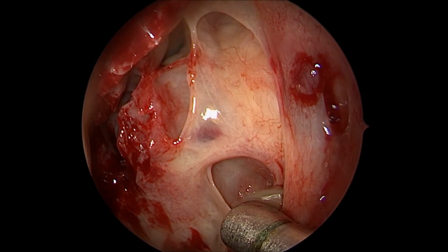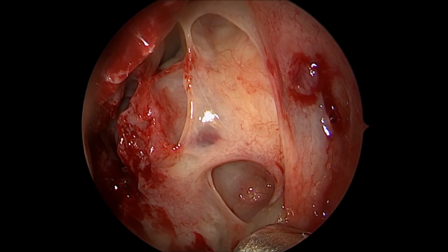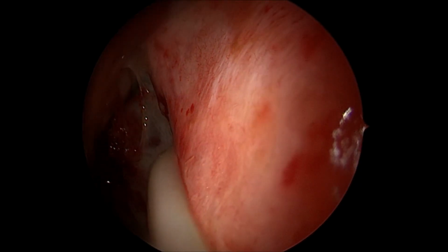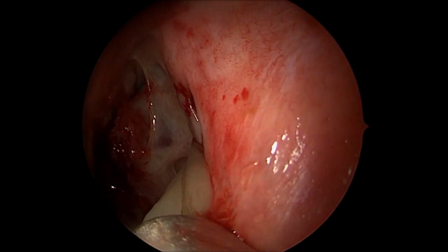More secretions are being sucked out, which had been in the sinuses because of the blockage by the mass in the middle meatus. Very thick mucus secretions.